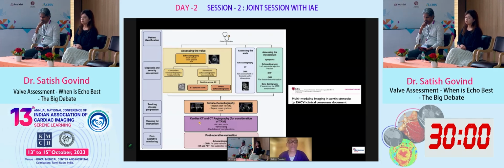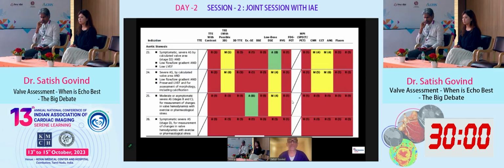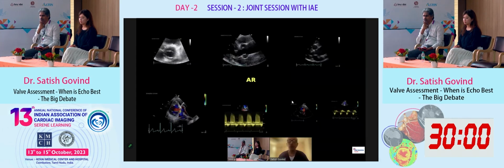And then for planning the intervention, of course, there is a very, very limited role as far as echo is concerned. But once the intervention is done, in terms of the transcatheter interventions, then again, for monitoring, echo comes back here. So this is the way echo is useful. And then you have these various possibilities. You can see that when you compare with the other two lesions here, there's not much of a role of echo in aortic stenosis. It is just the 3D TEE and the stress echoes, which are seen on one side, while the CMR and CT are on the other side over there.